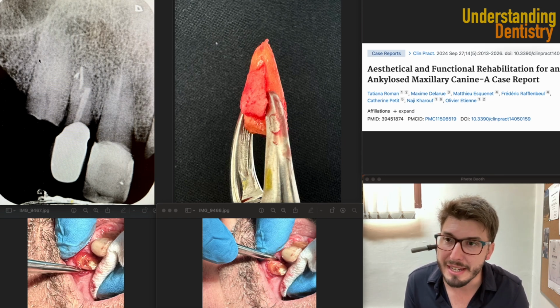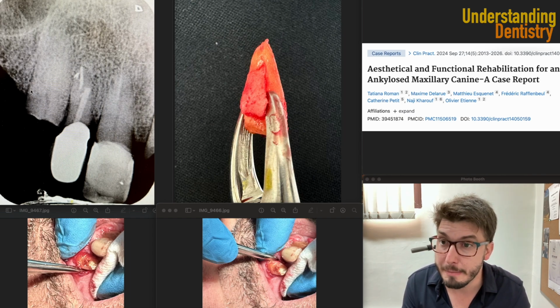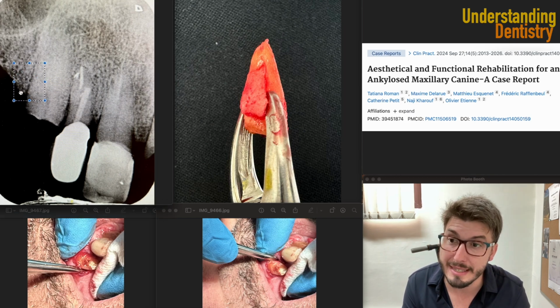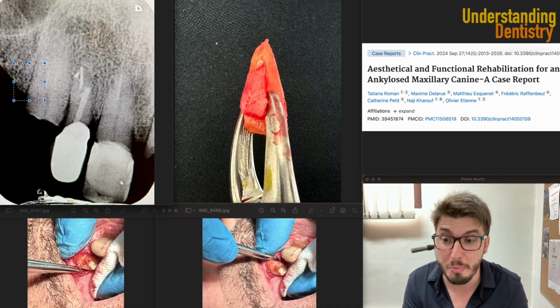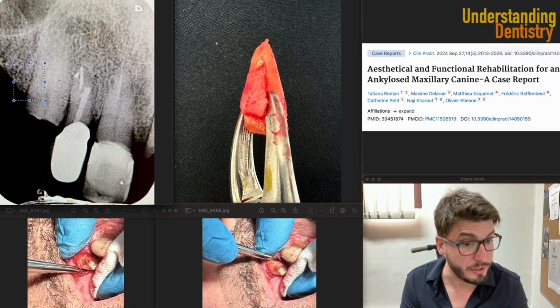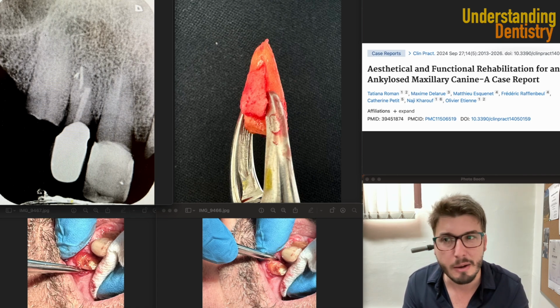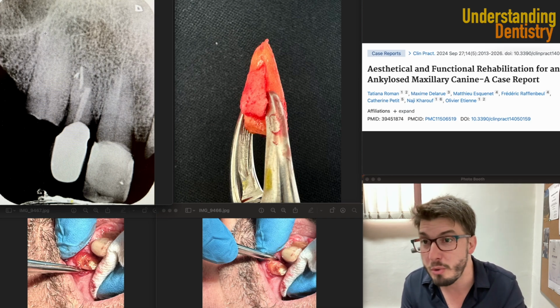Now we have here what we need to diagnose before an extraction on the radiographs. And one of the most important things is the periodontal ligament space. So we have here the periodontal ligament space. We do have a nice periodontal ligament space here in continuation with the distal alveolar crest. So here you have some space, and that's the space you want to open and to widen with your elevator for the extraction. Here you have space, but now try to follow this space upwards. So now we have the periodontal ligament space, and then what's going on here, you don't see it. Okay, so you don't even see what is lamina dura, what is periodontal ligament space.